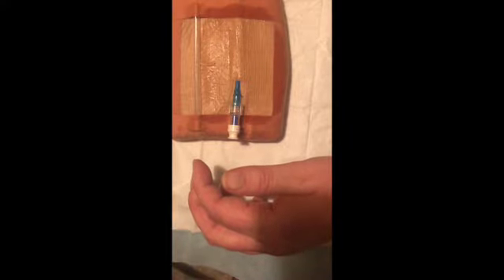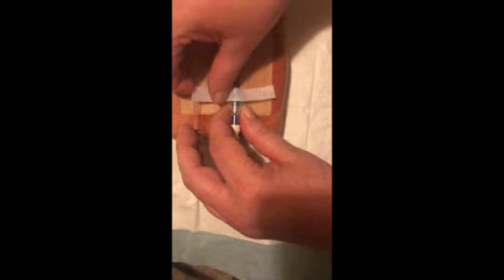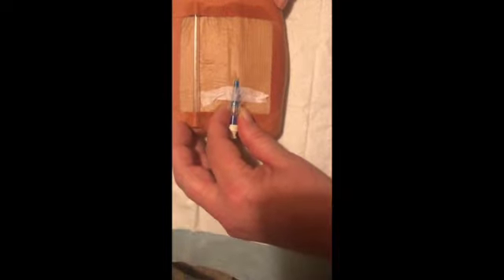Okay, so lift your bung up a little bit to get the dressing in and around underneath. And with your cannula dressing, I like to pull the steri-strips off. Or entry point for liquids or pathogens under the dressing. And remove the external border. And again, securing your bung, you want your steri-strip to go over your cannula port. Like to pinch to ensure that the tightness of the bung's there, and actually pushing that steri-strip down to prevent being able to pull the cannula out.